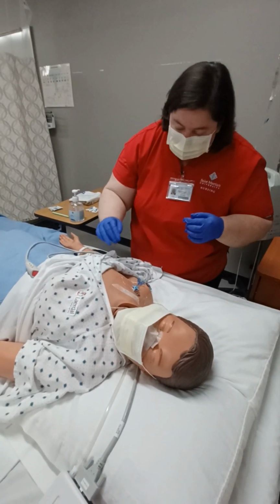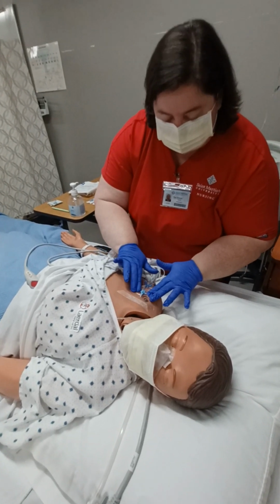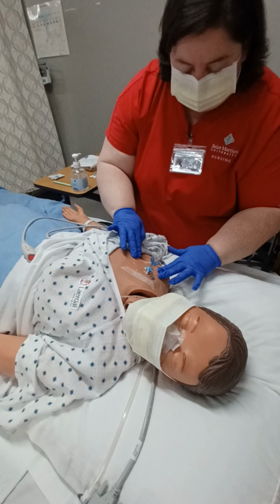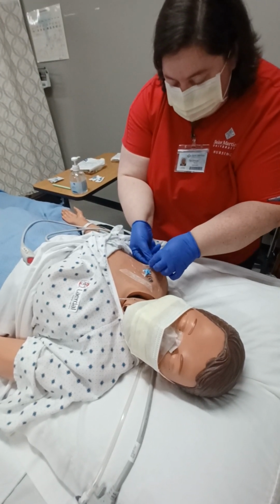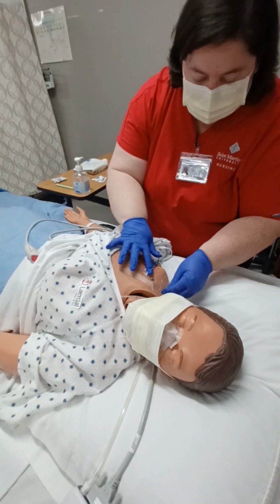So I don't see any redness or irritation. All right, and then I'm going to go ahead and just touch really quick. Let me know if you feel any pain or tenderness or discomfort. No? Okay. No nodules or lumps felt. All right. And just make sure that both of these are clamped before we get started. All right. And then I'm going to go ahead and get started if you're ready.